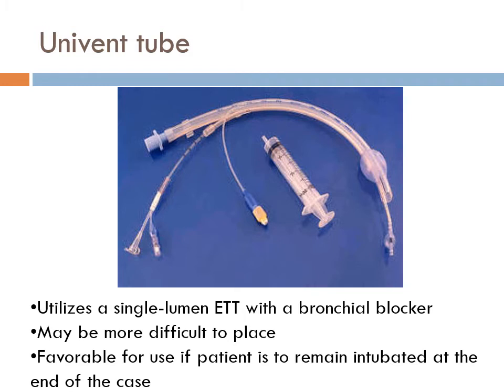What do you think the most obvious thing is when you don't know what's going on and something's not right? What would you do normally? What would you do with patients when they're not saturating great, or oh my god, they extubated themselves? What's the first thing you do on the ventilator? 100% FiO2 to buy yourself some time, and then the next thing to do is double the alveolar capillary membrane space that you're ventilating by going up on both lungs, right? Hey, having problems, we're going to ventilate that lung, tell the surgeon, hold up, right? Then go in and look, and call it out, something like that.